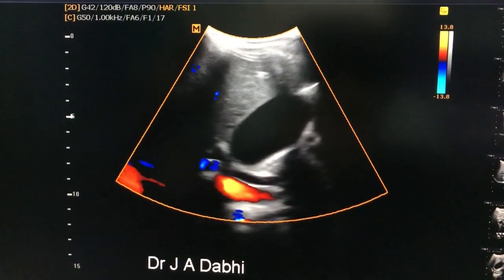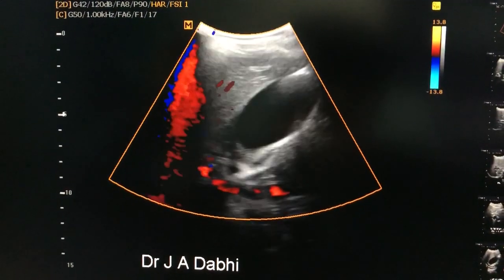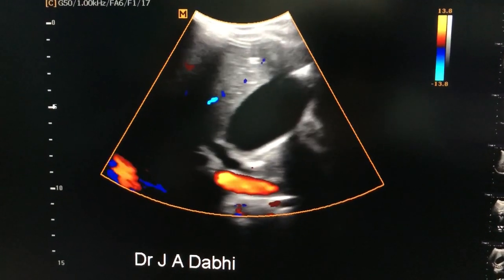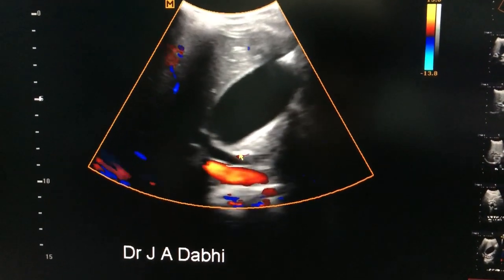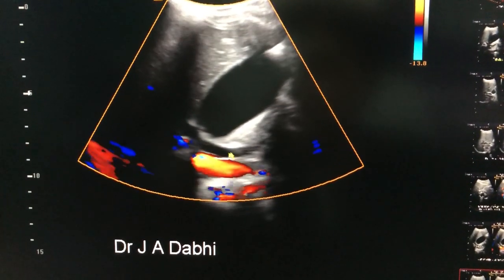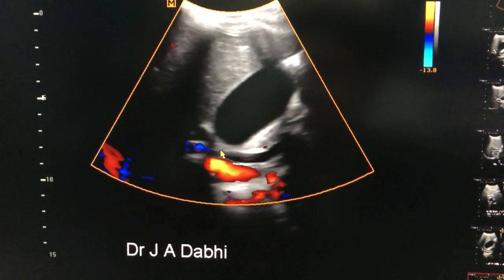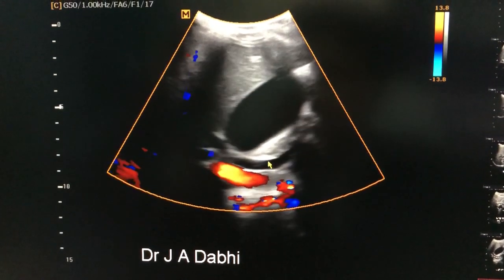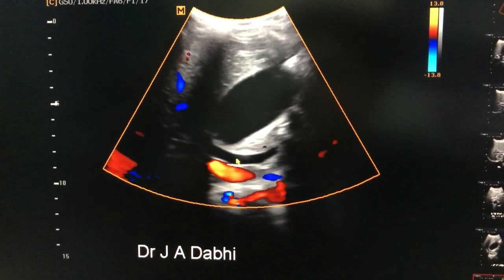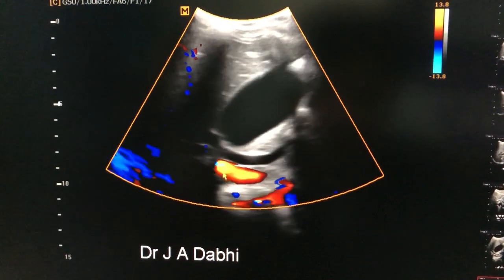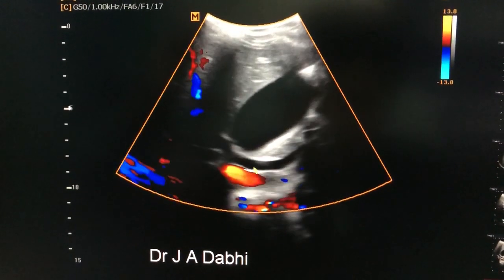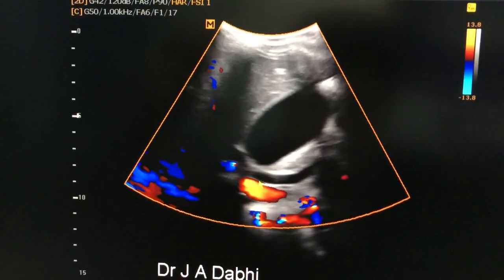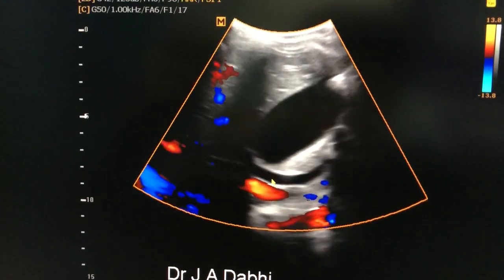This is the common bile duct. This anechoic area is the common bile duct which is connected with the pancreas over here, not showing colour flow. This is the portal vein and this is the gallbladder. So the common bile duct is located between the portal vein and the gallbladder in the side view.